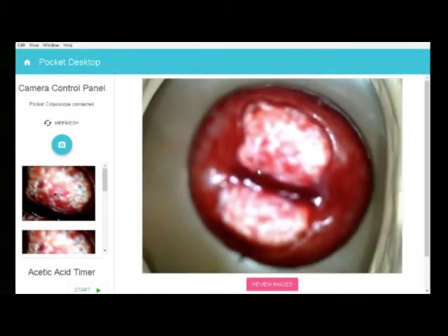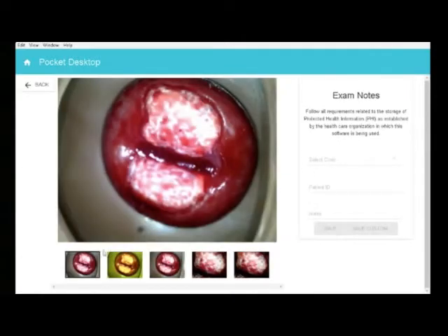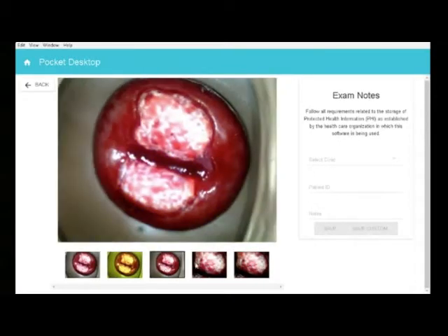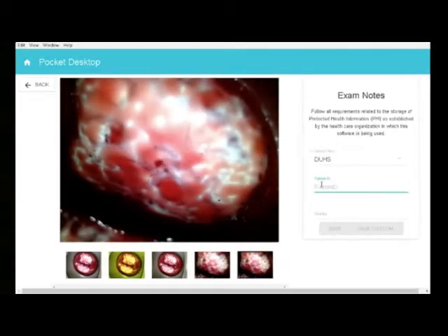At the end of a procedure, click the Review Images button to see a collection of all the images that were taken during a session. Then, under the Exam Notes section, you may enter information about the patient to tie these images to that patient.